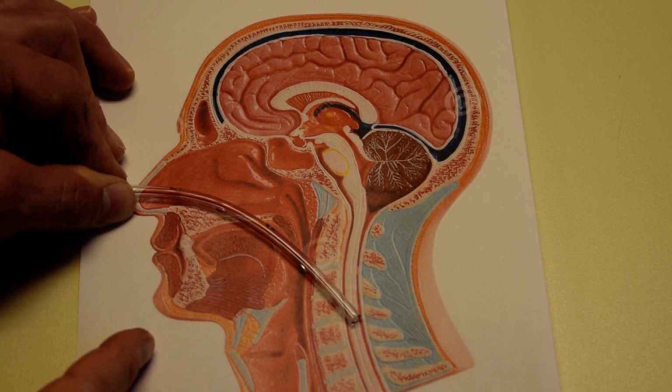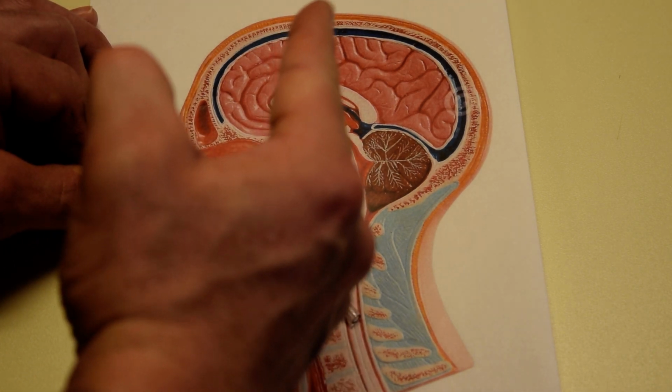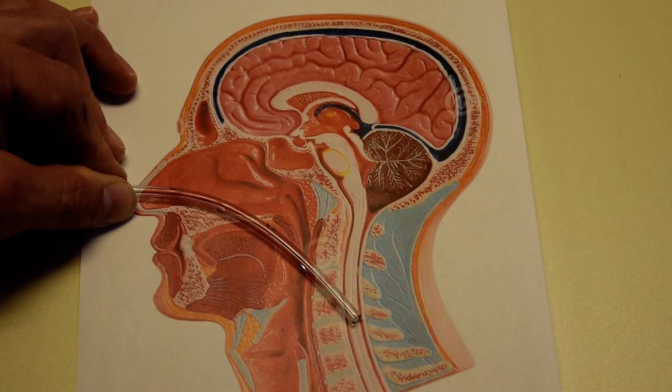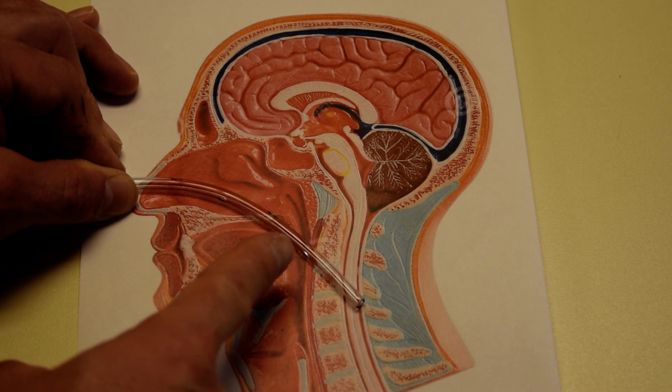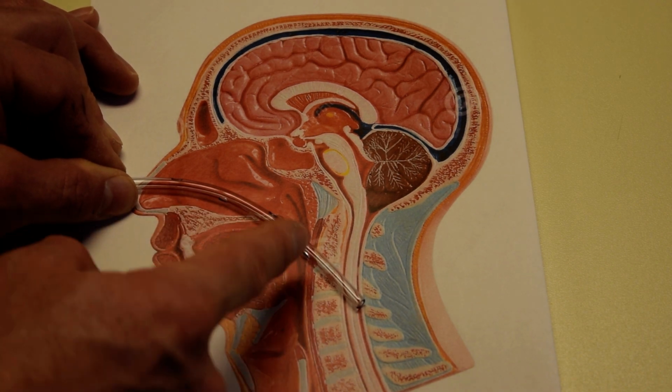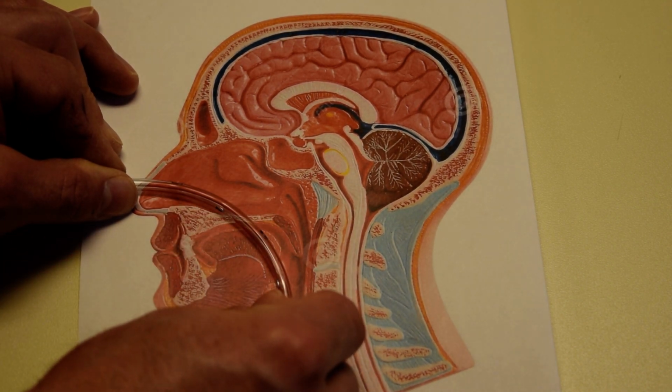Another good tip is that when the patient's head tilts back, which is an automatic reaction to having this procedure done, it really closes off the angle that you're trying to get to.